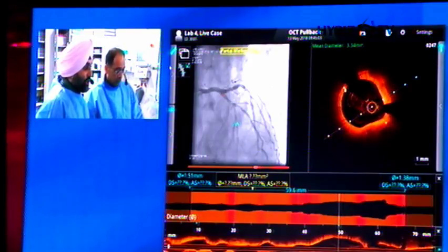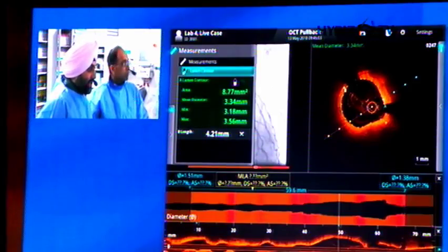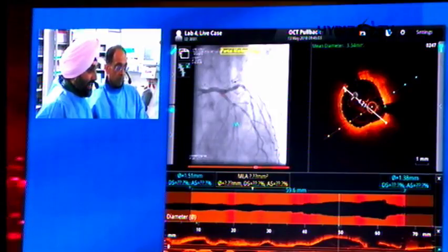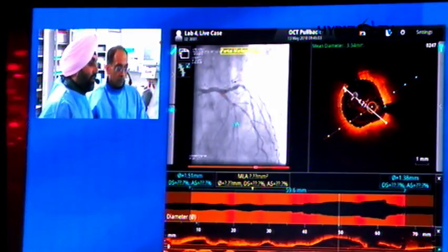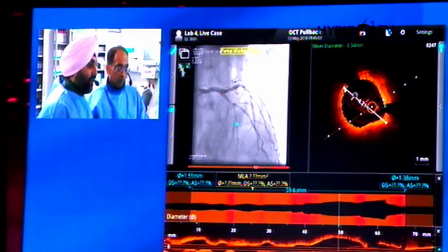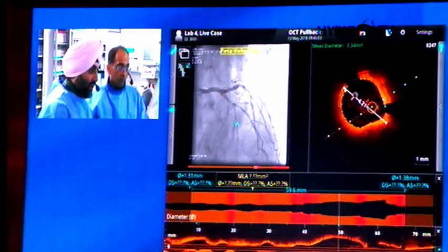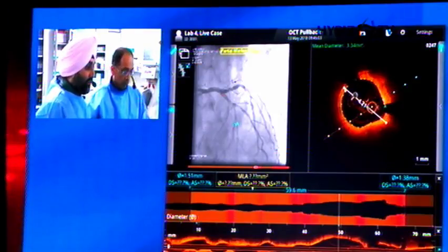So if I just show you there where we decided we were going to land with the co-registration, the luminal mean diameter is 3.3. When we measured EEL to EEL, it was just over 4. We decided that just because there was so much atheroma there, not just to go down 0.25, but to go to 3.5, knowing that this stent can go up to 5.5. A 3.5 will go up to 5.5. And we're just at the position now where we're going to re-OCT to look at stent expansion and apposition.